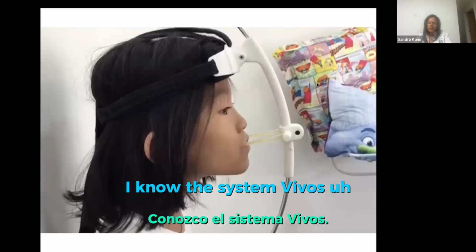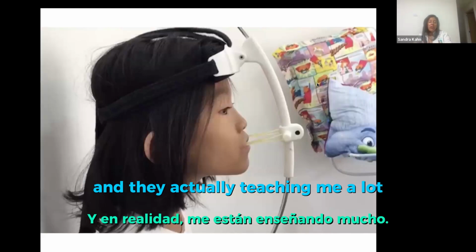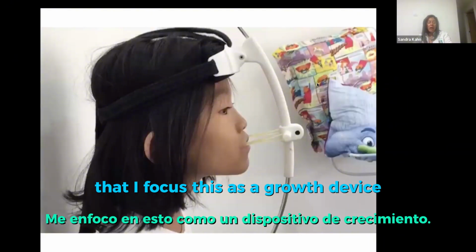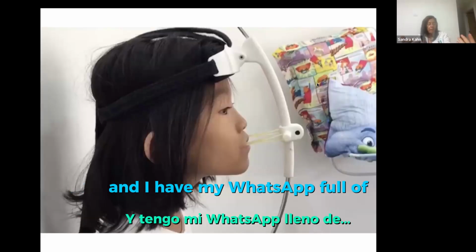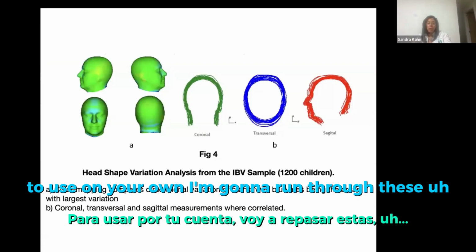I know Vivos uses a lot of bows. They use it on adults with their device, and they are actually teaching me a lot, because I will not use this in an adult. It's not part of what I recommend. I focus this as a growth device, but I know that adults use it successfully, and I have my WhatsApp full of cases that have improved through using the bows. So this is a tool that you need to learn to use on your own.